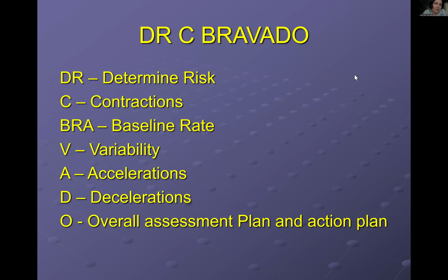Decelerations, which is the reverse, so when the fetal heart rate goes down and then recuperates. And these decelerations, depending on whether they are early or late, and what makes them early or late is their relationship to the contractions. And finally, the O, your overall assessment, your plan, and what you're going to do if you need to do anything.